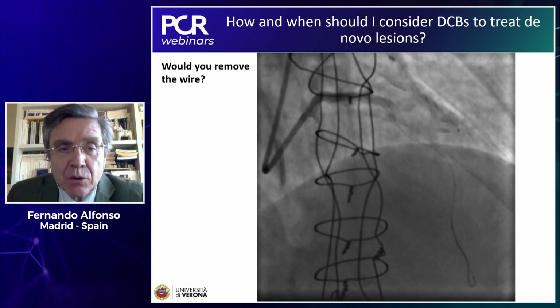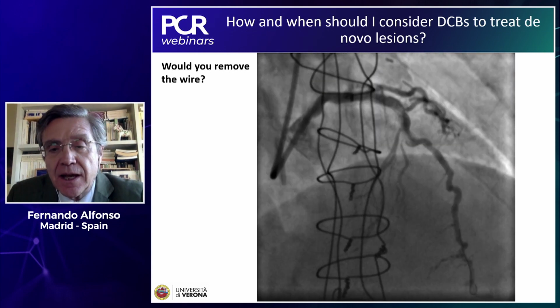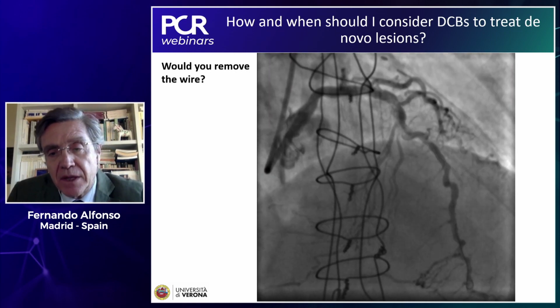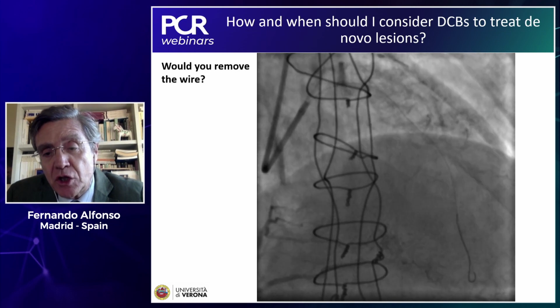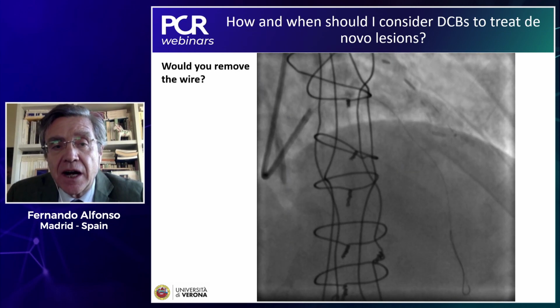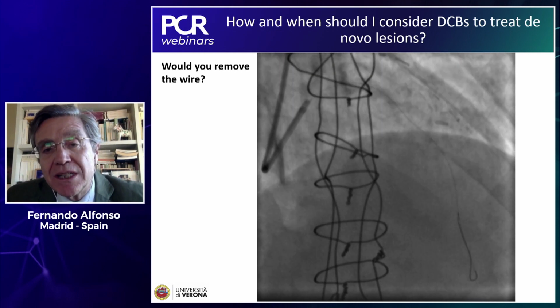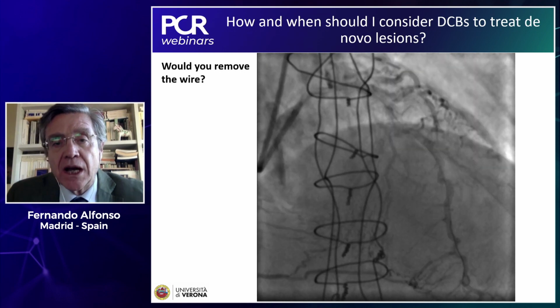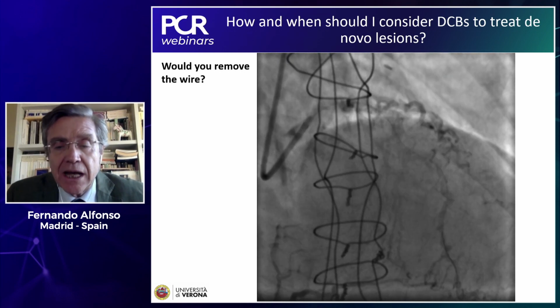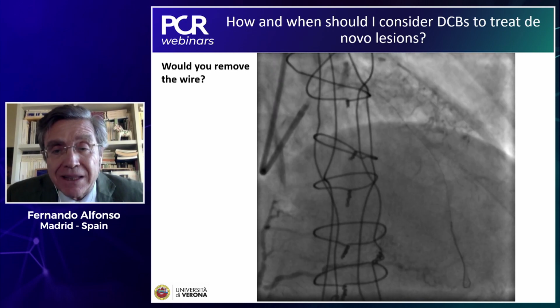This one I would be in doubt. And considering it's a proximal LAD, to be on the safe side, stenting that can be much better. Because the other thing is that there is a wire there, so perhaps these flaps are pushed away by the wire. So this is not the result I tend to accept in a drug-eluting balloon strategy. This is a little bit borderline. You can leave it, and perhaps it will be a beautiful result, but I think there is a risk there.